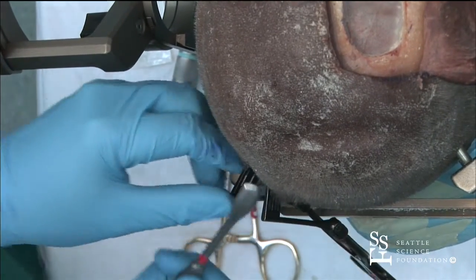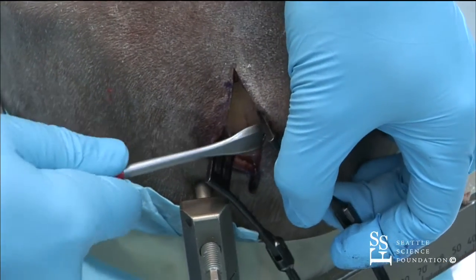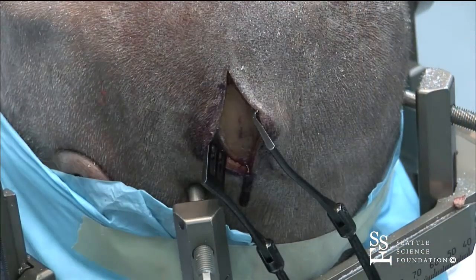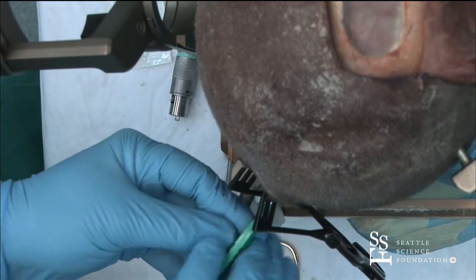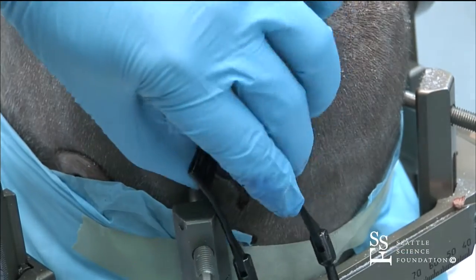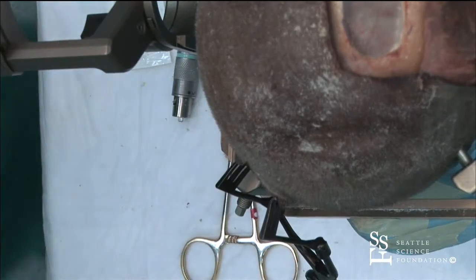Most live patients, it's not so hard to tunnel. And NeuroPace has their own burr hole cover to lock it down, but it also uses a 14 millimeter round bit that you typically would use for DBS.